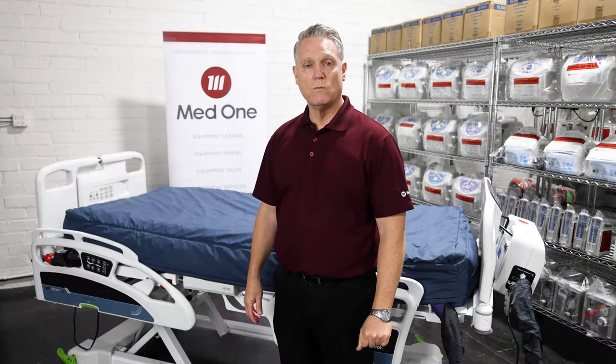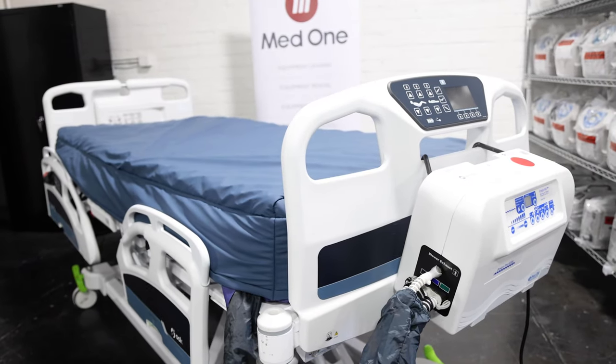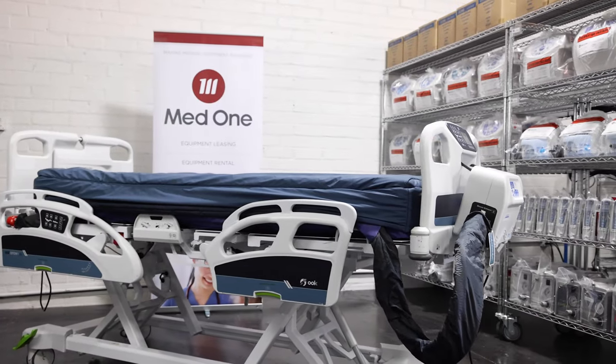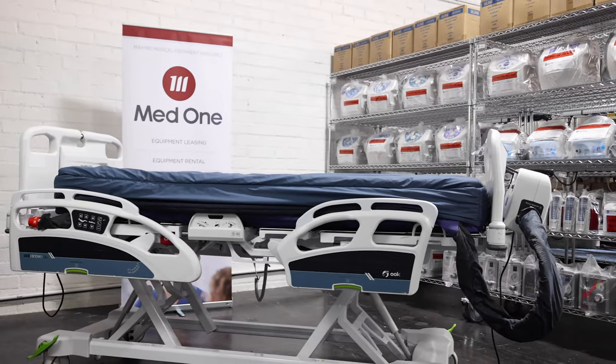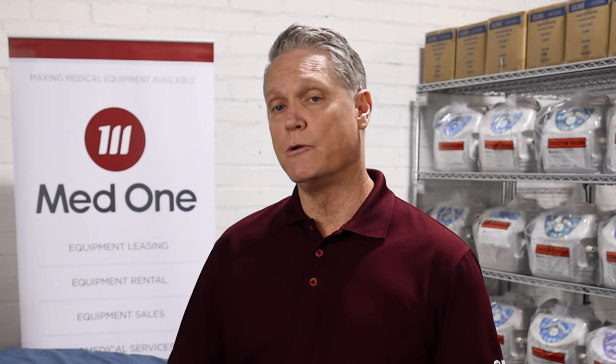Hi, my name is Mike Daniels with MedOne Group. I'm excited to present to you today the Blue Chip PowerPro Elite Mattress. I've been in the mattress support surface business for over 25 years and I think this is a great product that you're really going to like. This is a low air loss therapy mattress that will work with a variety of your patients. Today we're going to go through the features and benefits of that mattress as well as a general overview.